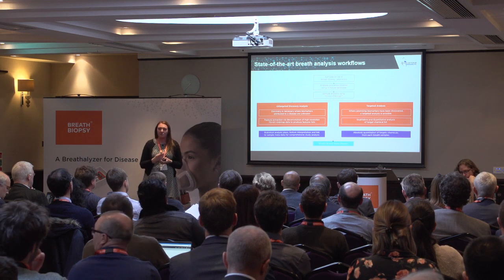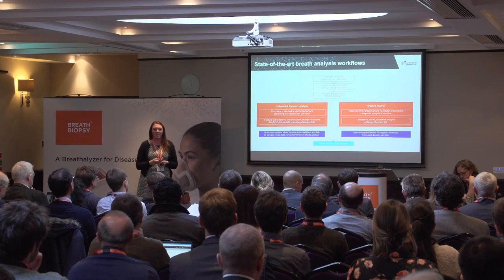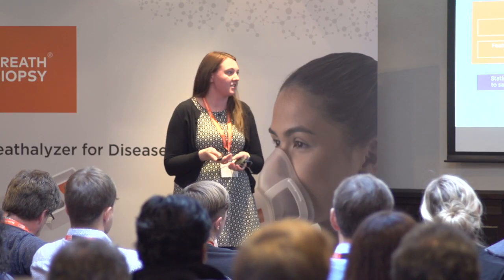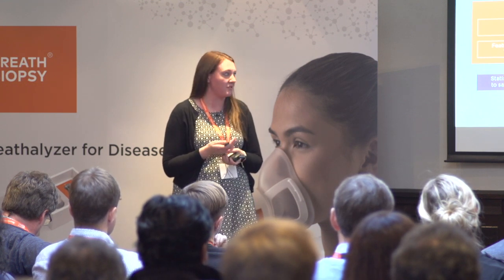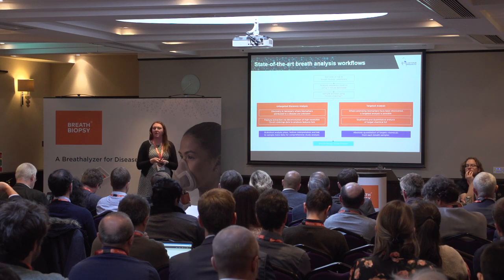The benefit of that is that we can use the targeted analysis to quantify the performance of the instrumentation and the breath sample collection, as well as providing a discovery analysis to look for those novel biomarkers and produce feature lists that can go on to statistical analysis and provide data for clinical interpretation. So the goal of this is to standardize the underlying analytical platform to allow features to be detected, identified, and interpreted in order to produce an end breath biopsy study report.